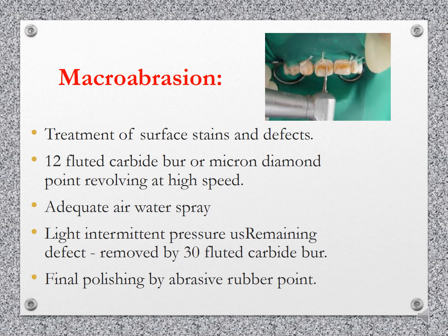Macroabrasion. It is used for treatment of surface stains and defects. Here a 12-fluted carbide burr is used, or a micron diamond point revolving at high speed is utilized. Adequate air-water spray should be used as coolant and for visibility.